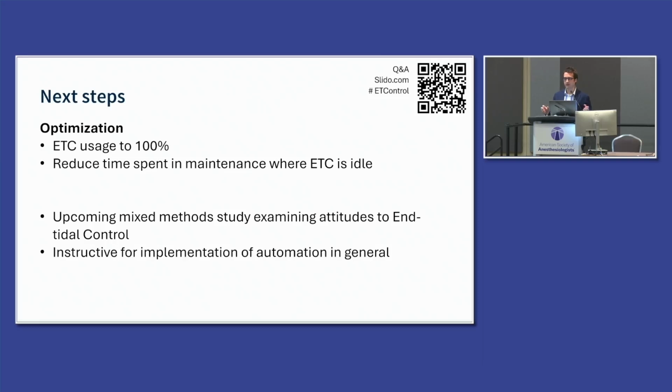If you look at the average flow for the case, the closer that is to 0.5, the better job you've done. If you get that switched on immediately down to 0.5, then your mid-case and average case flow should be the same, and that is where you've optimized end-tidal control. So that's kind of what we're using to try and optimize.